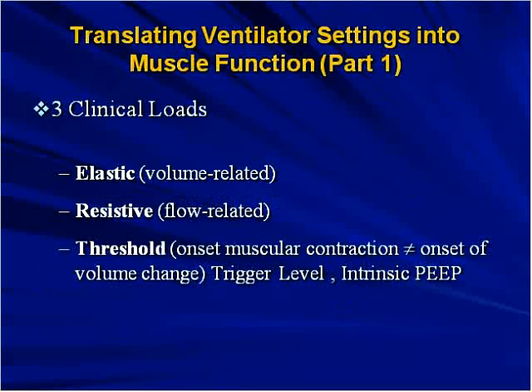Now, how do we translate this into ventilator settings? There are three clinical loads that we need to be concerned with, and they are the elastic load, which is related to volume, tidal volume, or the tidal volume demand of the patient. Resistive loads, which is related to the flow rate, either the flow rate generated by the patient or the flow rate we set on the ventilator.